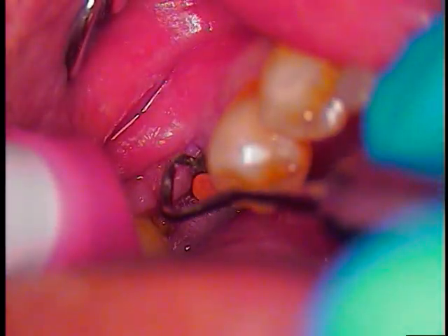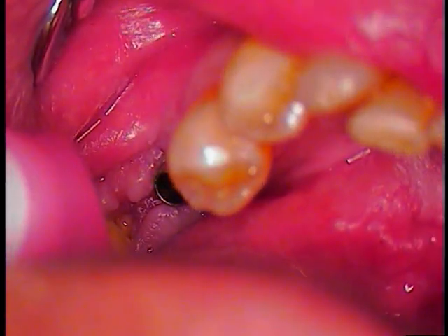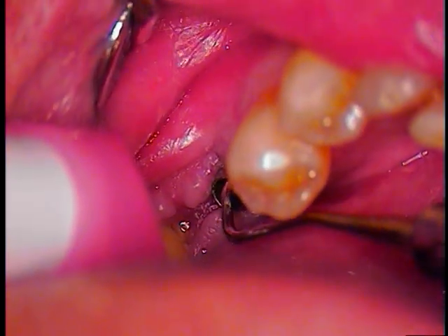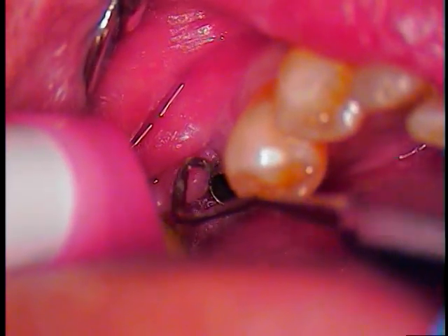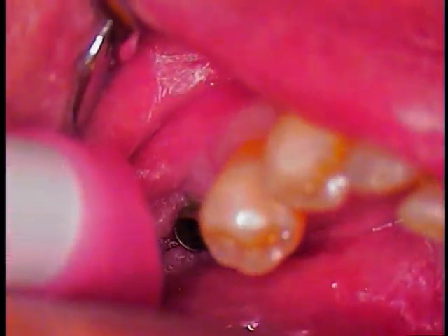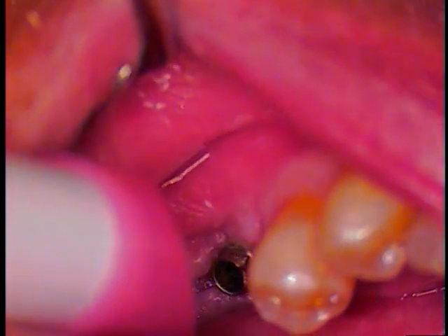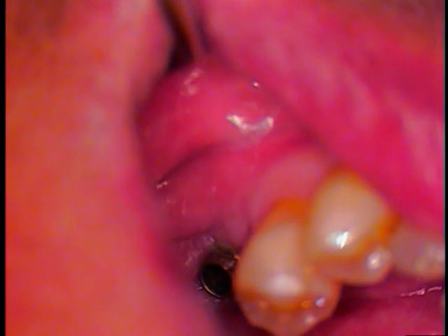We'll just pull that out gently and remove it. There's the inside of the internal aspect. Let's just see if this decides to walk out on its own. Let me have a micro suction tip.